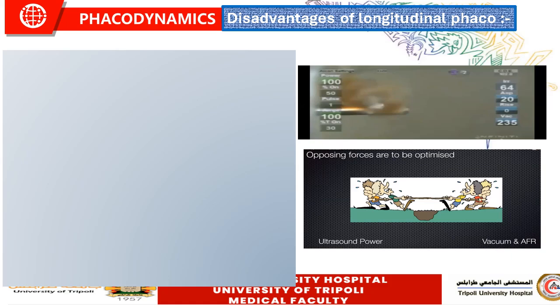What are the disadvantages of traditional longitudinal phaco? Before we speak about the disadvantages, we should mention: is there any advantage for the longitudinal phaco? The answer is that the longitudinal phaco is very useful in the initial stages of phaco emulsification, in the sculpting and the trenching, especially in very hard nucleus.